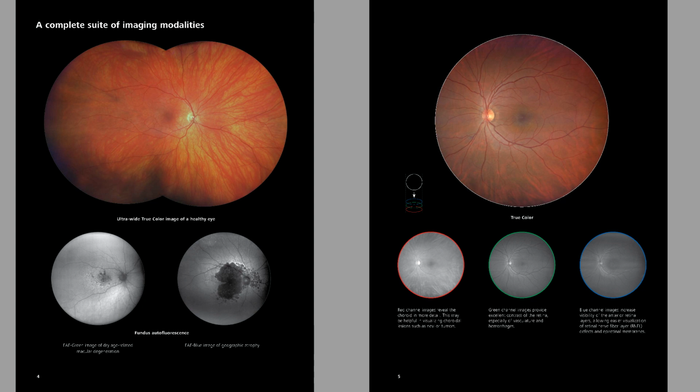In contrast, there are scanning laser ophthalmoscopes, and scanning laser ophthalmoscopes, they're great. They generate these really high contrast images. They're very valuable in angiography, but they're using monochromatic laser light, right? Monochromatic laser light is a single wavelength of light. Many of these devices incorporate 2 or 3 lasers, but that's again 2 or 3 of the wavelengths that compose the visible light spectrum, right?